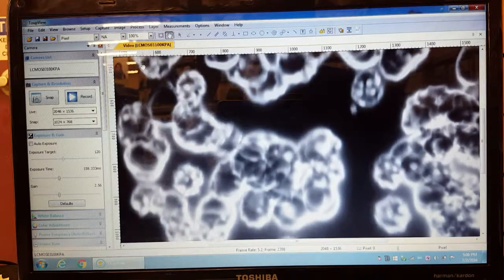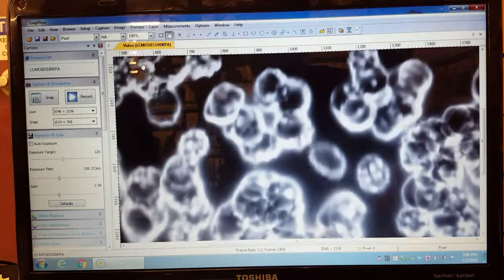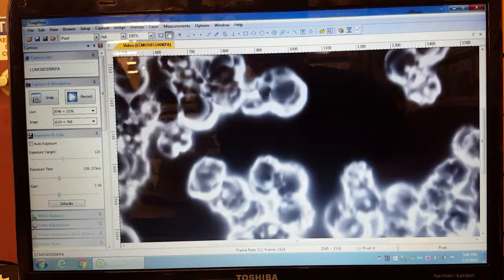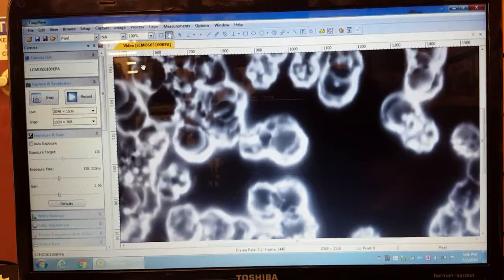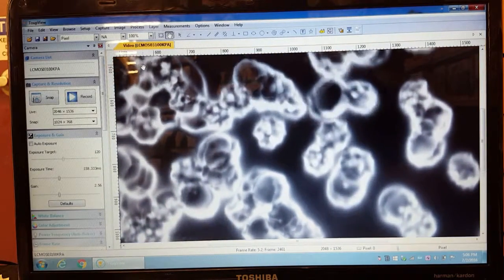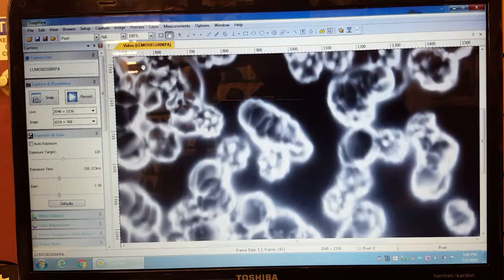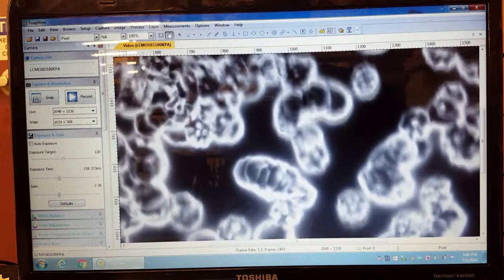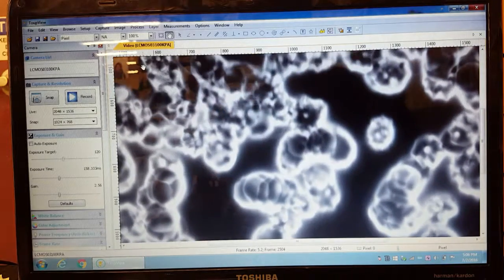And now, you're not rouleaux. Rouleaux's when red cells look like a slinky. Your cells are pretty good. You need a little more oxidation, and I would think that you're a little bit acidic right now, and you had beef. Well, that, and also I have coffee. Oh, well then. So I had coffee today. You're probably like a 5.5.